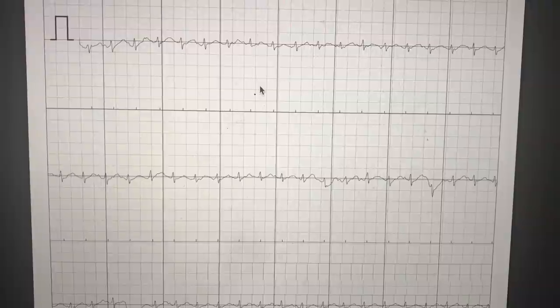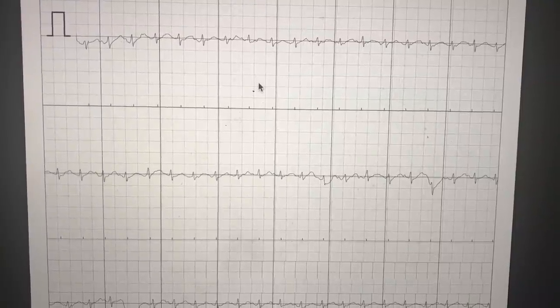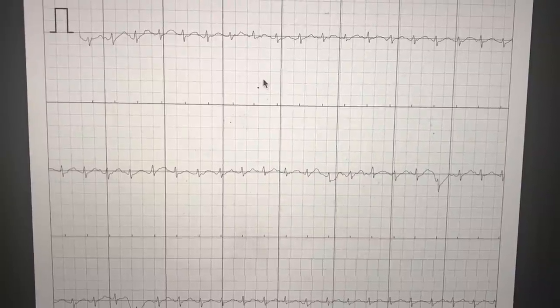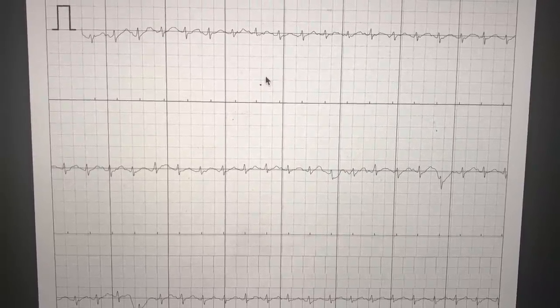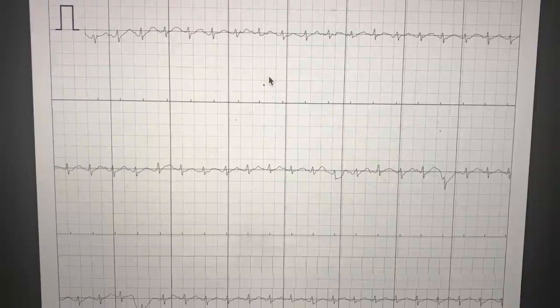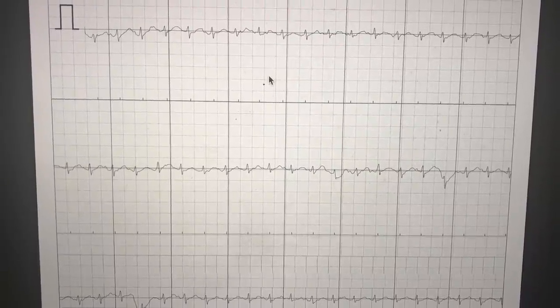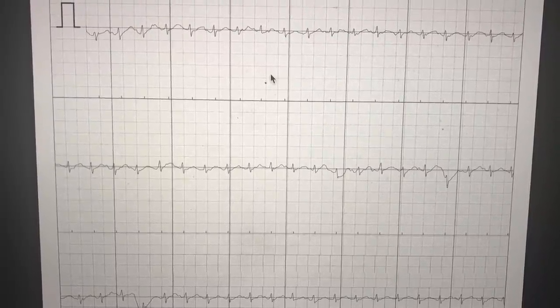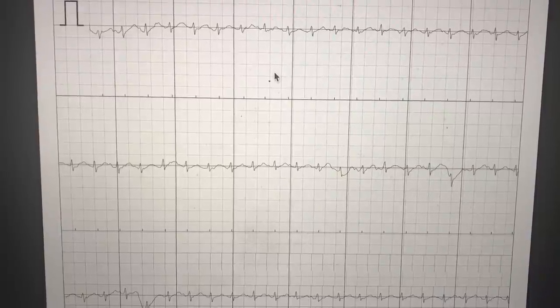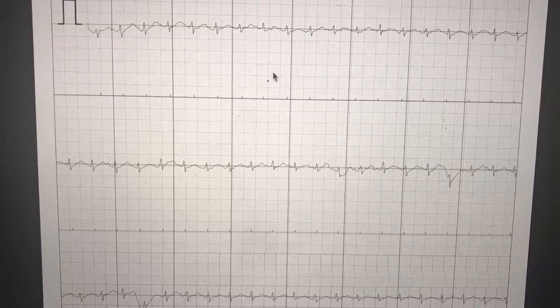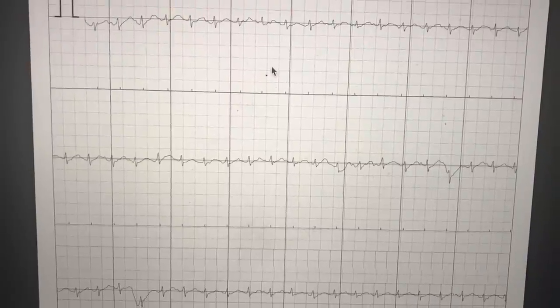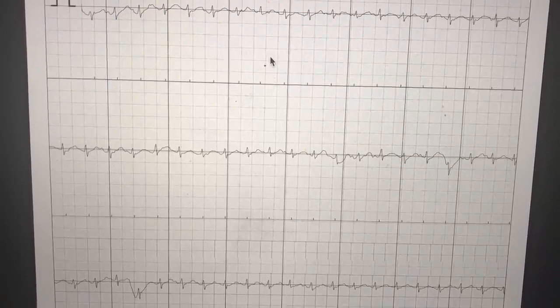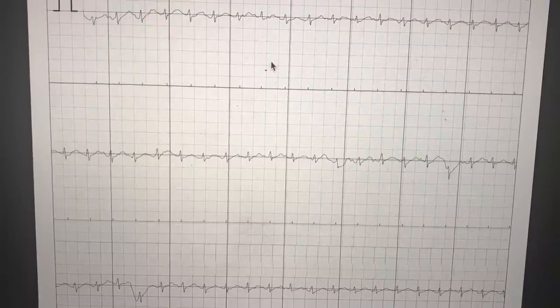What I wanted to do is something really quite interesting today, because a lot of people I speak to have palpitations. There is an app available called Kardia — K-A-R-D-I-A. This app can be downloaded on your phone, and they provide you with a phone case which has a couple of sensors. You hold them when you get your palpitations, press on the app, and you can record a single lead ECG on your phone. You can then store this ECG and send it off to someone for analysis.